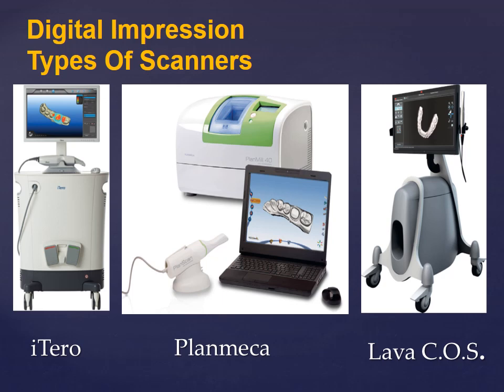Nowadays we have a digital impression type of scanners, and you know that the digital impression is a common method nowadays to be used for taking impressions, especially for implant and crown and bridge.